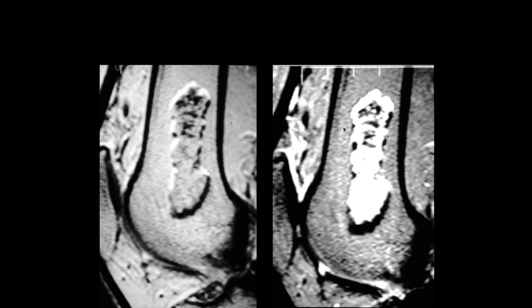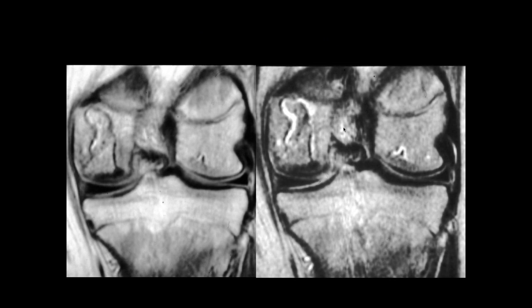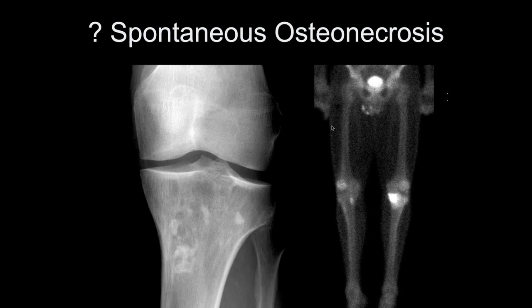Looking at this lesion — could be an enchondroma versus this other pattern. This is probably from the 1980s, showing an enchondroma versus a different pattern. This other pattern looks more like an infarct or AVN. This was a patient with lupus who had it in both femoral condyles. Here's another patient with acute onset knee pain — an older individual.